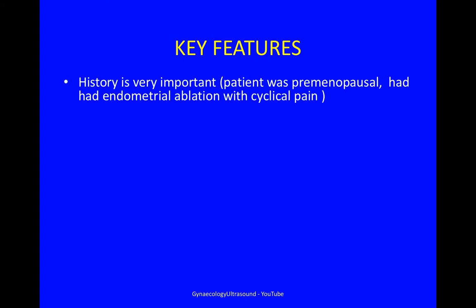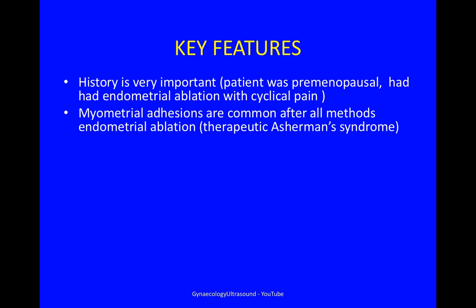The history is very important. The patient was premenopausal, she'd had an endometrial ablation and had cyclical pain. Myometrial adhesions are common after all methods of endometrial ablation. This is referred to as a therapeutic Asherman syndrome.